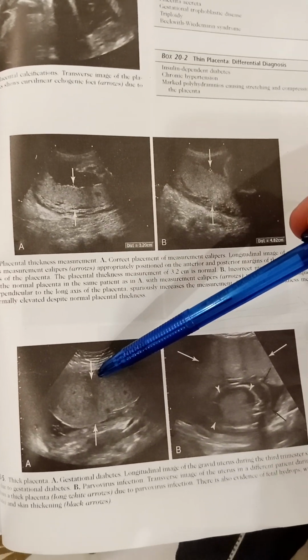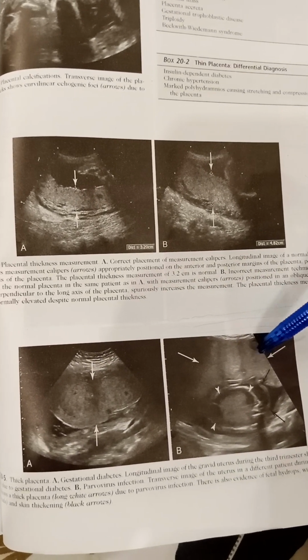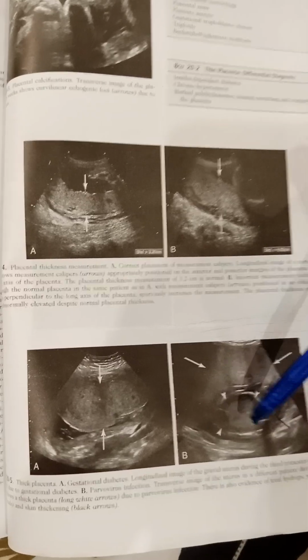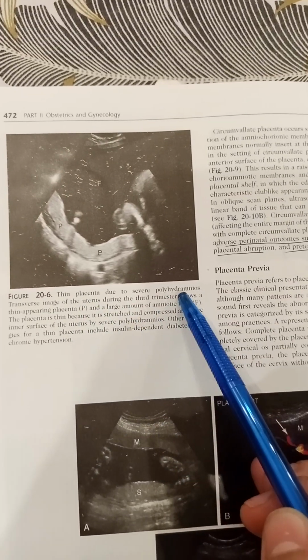Over here we have two thick placentas. This one is due to gestational diabetes, and this one over here is due to the parvovirus infection. Over here you can also see hydrops. So in the next page we have a very thin placenta. This is due to severe polyhydramnios.